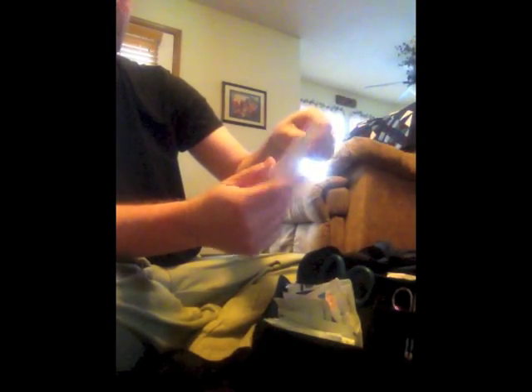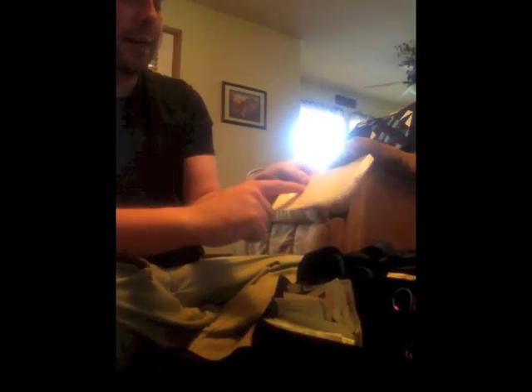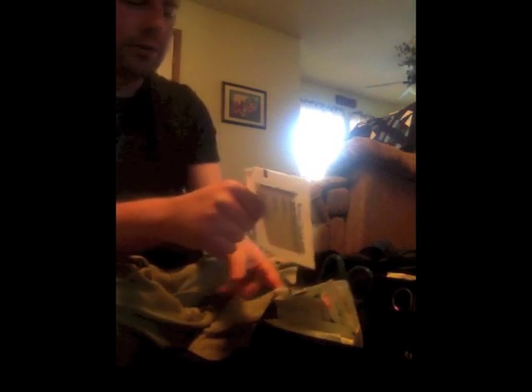And then I have over here these closure strips. They're basically just like a butterfly strip. But what I like about these better is the fact that they're really long, so you can cut them to size. So if it's a big cut or a small one you want to seal up, you can just cut it to the size that you want. So that's why I like them. So that's that. And on the sides here, I'll show you what I got.